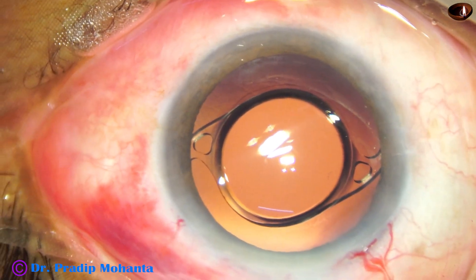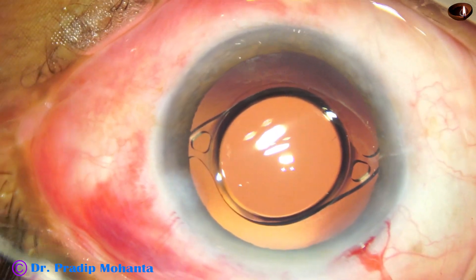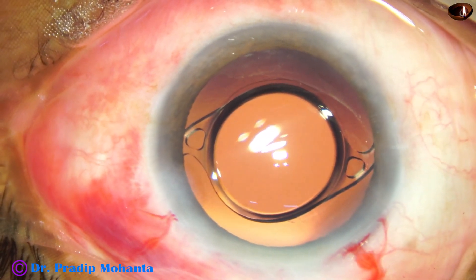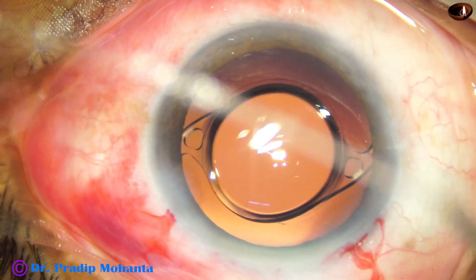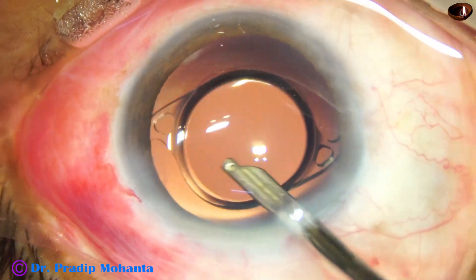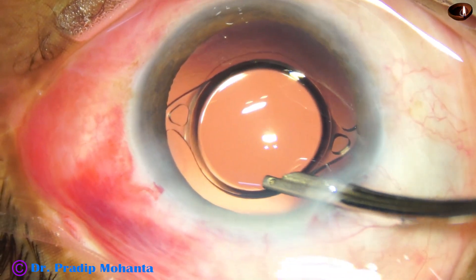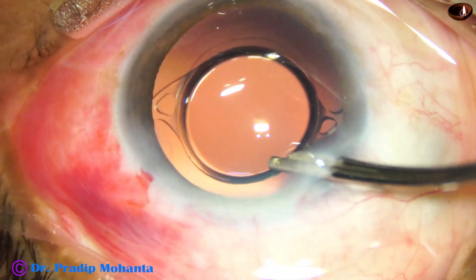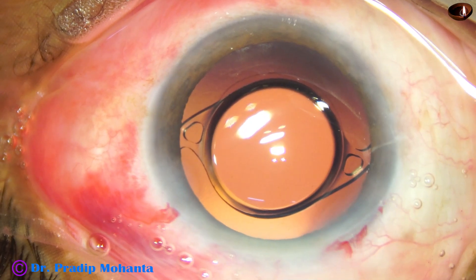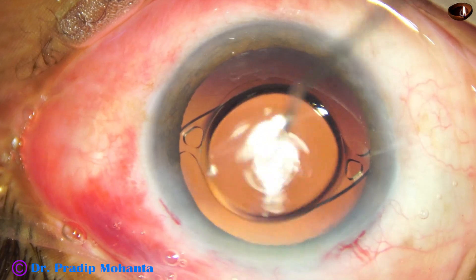Now this is a bit of moxifloxacin, and then we close the side port by hydrating the corneal stroma with BSS. Then our final lavage to conclude the case. This is very important — we must leave very clean fluid at the end of the surgery. The anterior chamber is nicely formed. A few drops of moxifloxacin are applied over the ocular surface and the case is concluded.